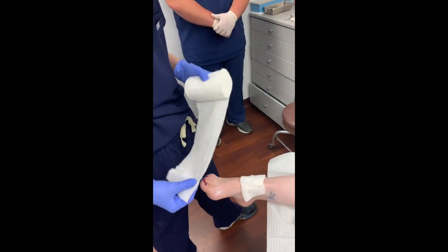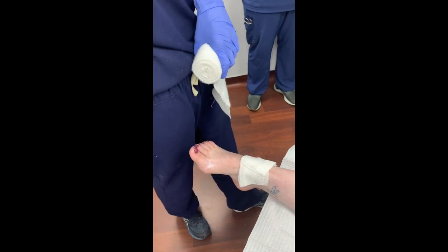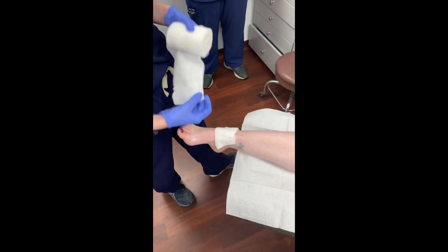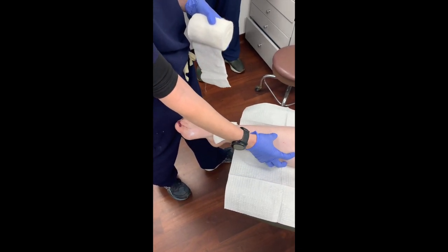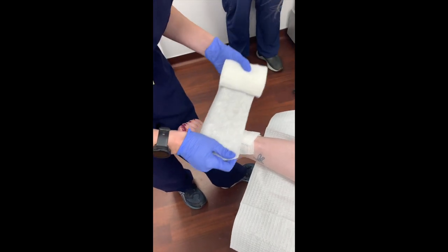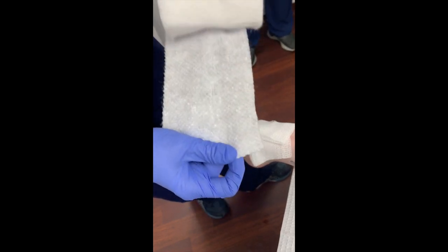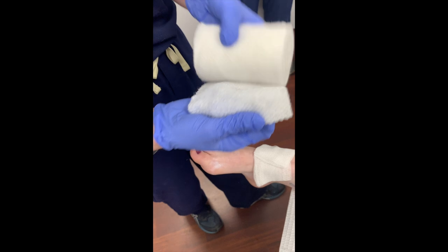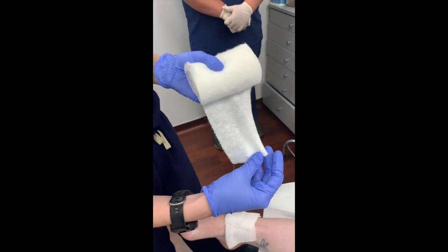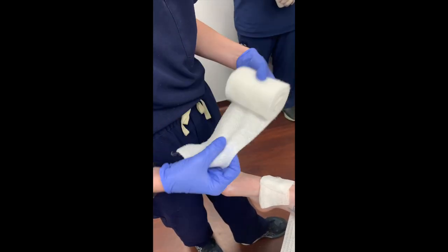We'll start with the cast padding layer. Our patient has a wound on her medial ankle — a venous stasis wound — so we're going to go from the toes all the way to the tibial tuberosity to allow for full right lower extremity compression. If you only compress just above the wound, you'll get increased edema just proximal to that dressing and won't substantially benefit the patient. My technique is to wrap up and into the arch for patient comfort. One thing to be mindful of is the snail technique — the shell is on top. If the shell is on the bottom, it won't wrap as easily.